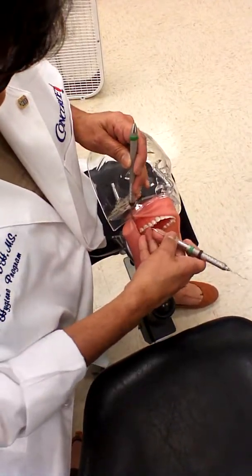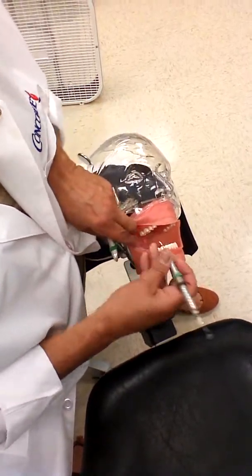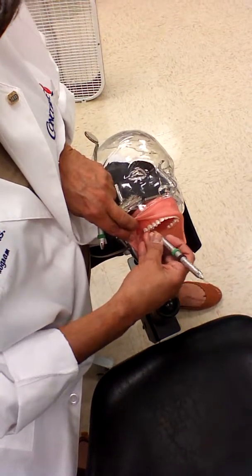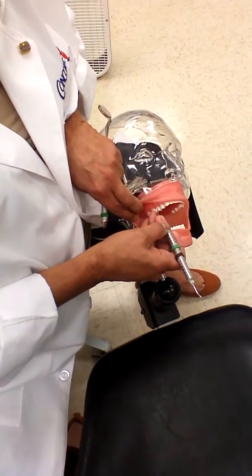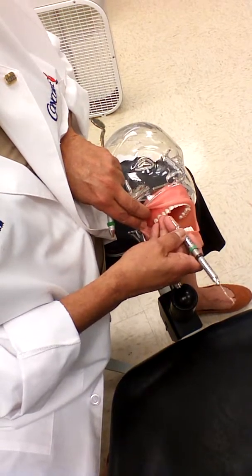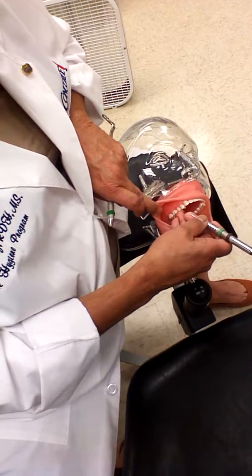See, again, as a board examiner, this is one of the things that we work on over and over before. Every time I go and do a board, we work on exploring and making sure that everybody does it the same way, because at the board, if it's residual, we're going to find it easily. And if you're holding it too tight, that's another reason that we need to really keep that light.